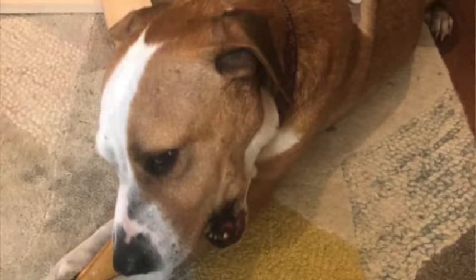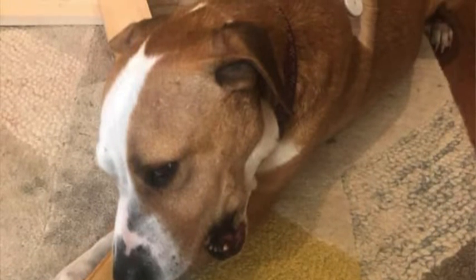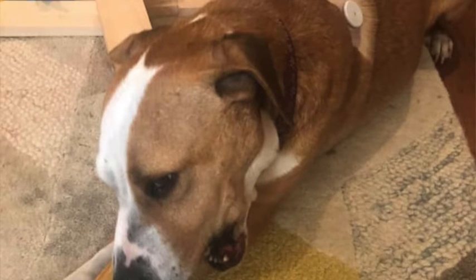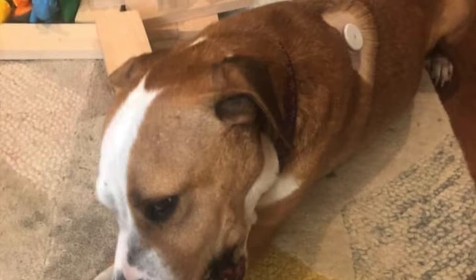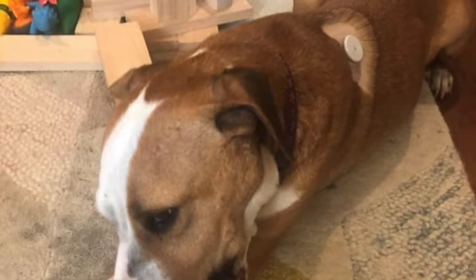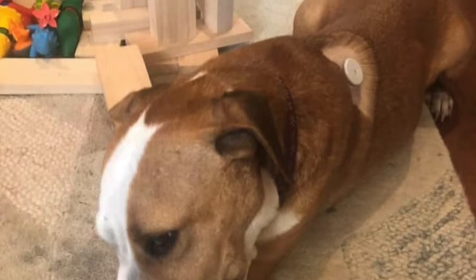What do most of your dogs think about wearing the CGM? That's a good question. The good news is the CGM technology has come so far that it's really not painful to place. We shave a little square, we prep the area. The Freestyle placement is the same as it would be on a human. So it's pretty easy. It's a tiny little wire that goes underneath their skin that gets the readings. So they really tolerate it pretty well.